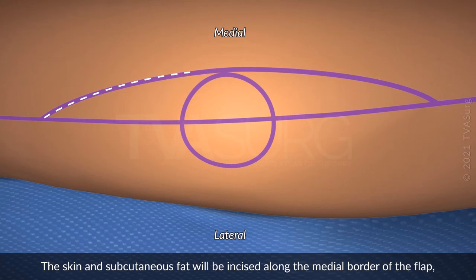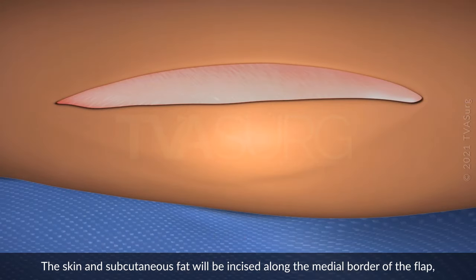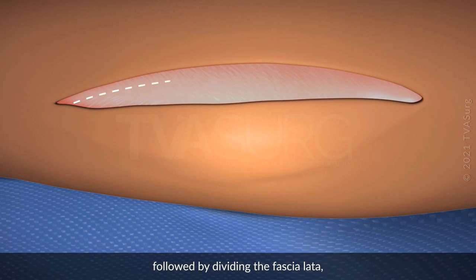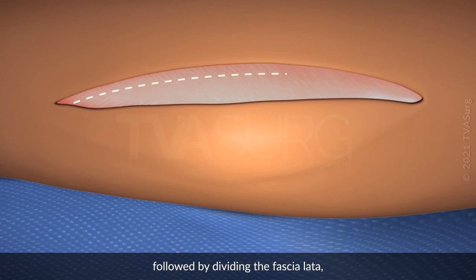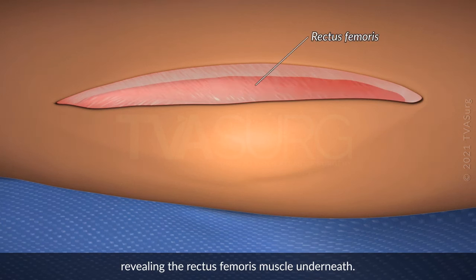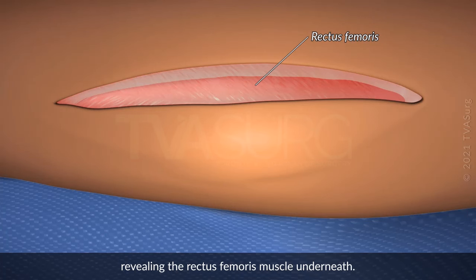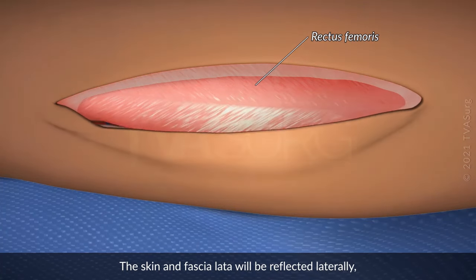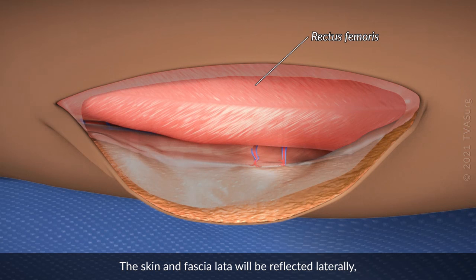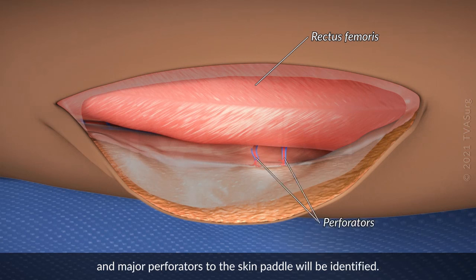The skin and subcutaneous fat will be incised along the medial border of the flap, followed by dividing the fascia lata, revealing the rectus femoris muscle underneath. The skin and fascia lata will be reflected laterally, and major perforators to the skin paddle will be identified.